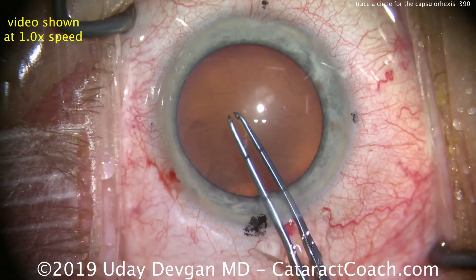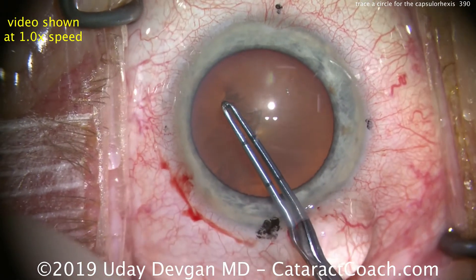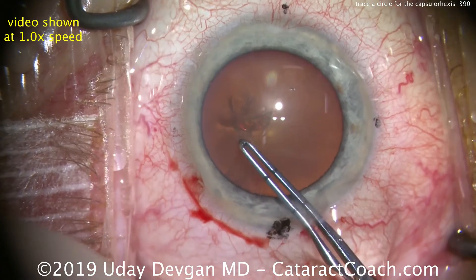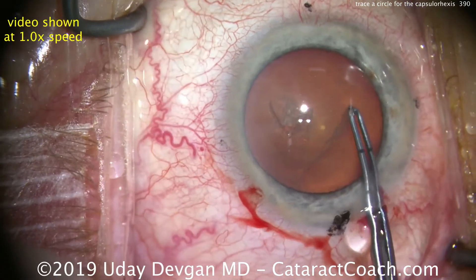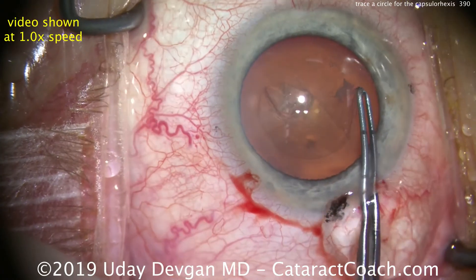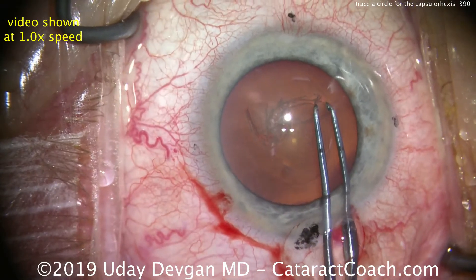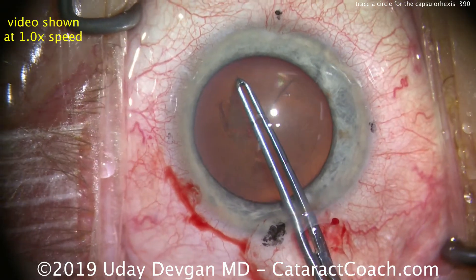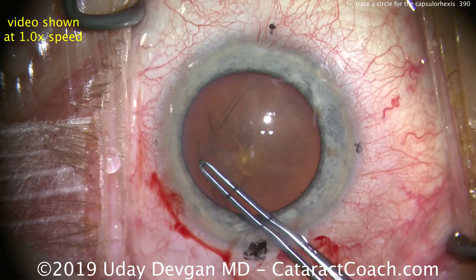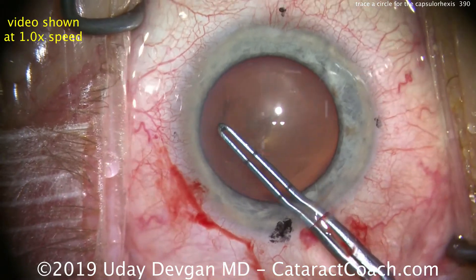I'll show this at normal speed. We poke in with the forceps, grab it here, and now look at the very tip of the forceps — it's going to pivot around in a circle.